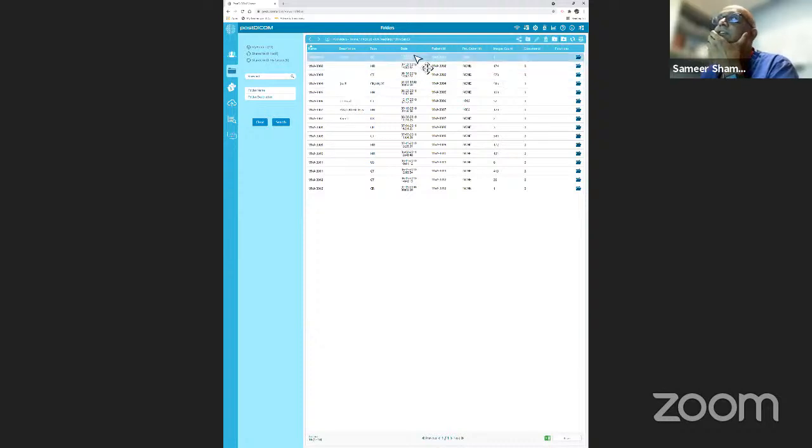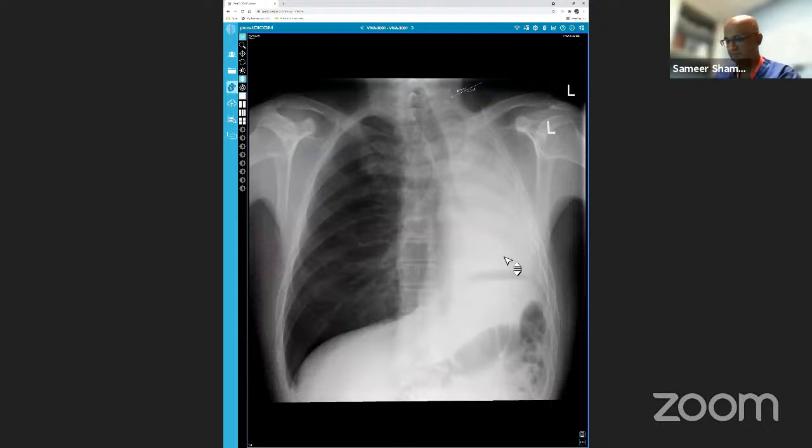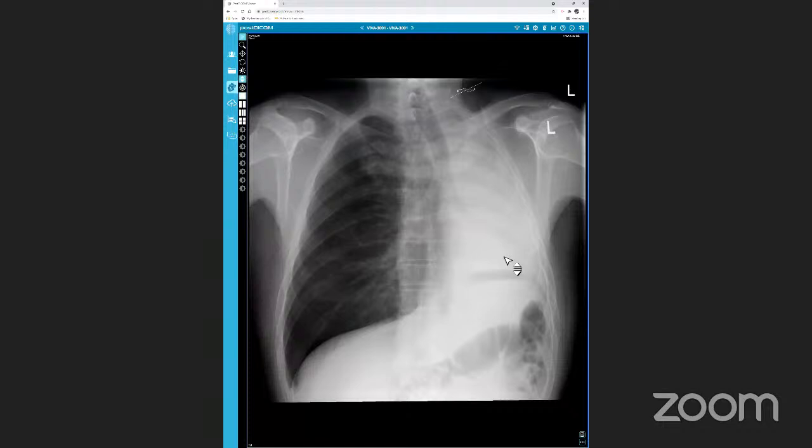Okay, Tom, this is your first patient. Just a chest x-ray in a routine reporting pile. This is a plain chest radiograph of a skeletally mature patient, possibly male. I don't see any breast shadows. There is a white out of the left hemithorax with what looks like volume loss, with a mediastinal shift to the left and possibly a raised left hemidiaphragm. I don't see any surgical clips. That would be one of my differentials for this appearance, but in the absence of any previous surgery, I'd be concerned about a complete left lung collapse.